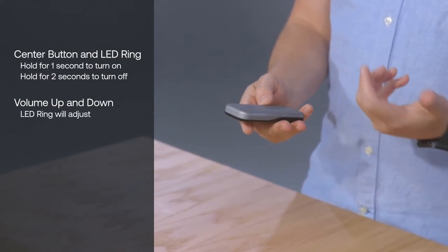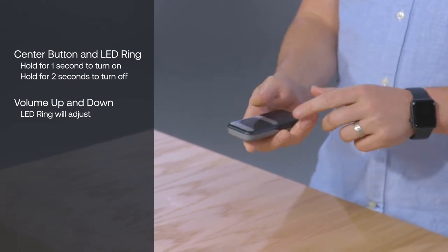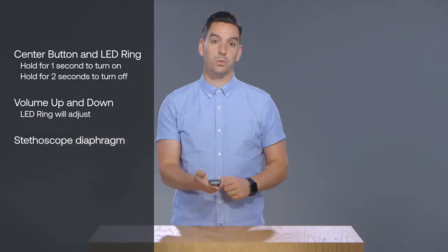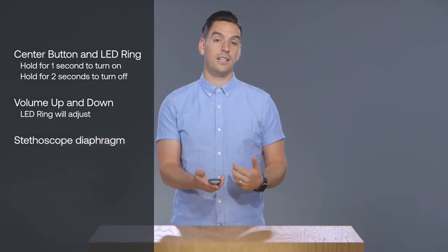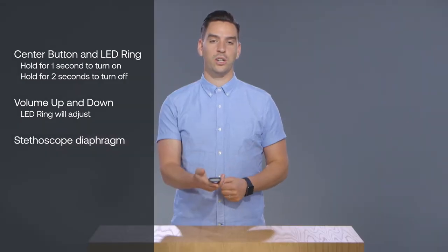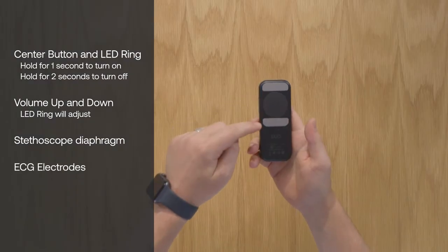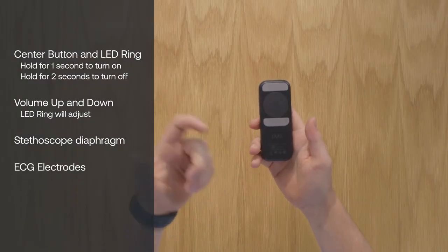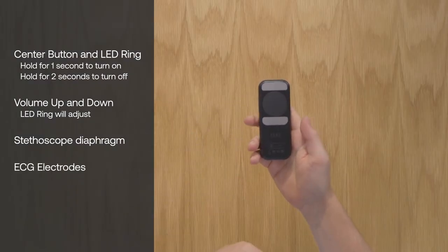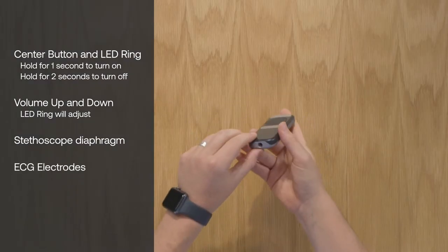On the black side of the Duo is a stethoscope diaphragm which captures the heart and body sounds during auscultation and two electrodes which comprise the single lead ECG.